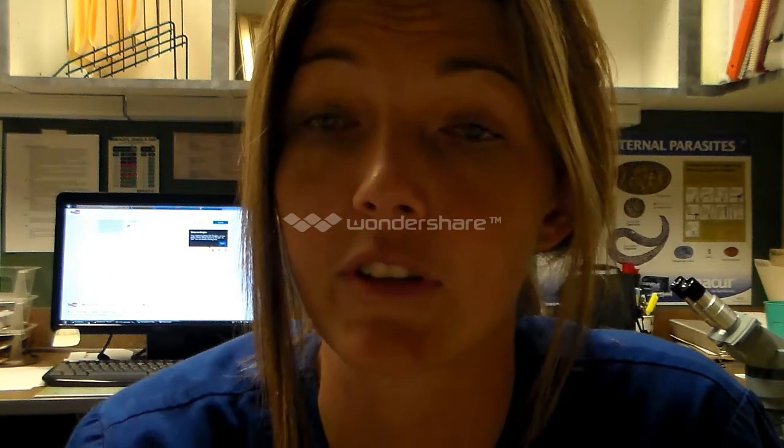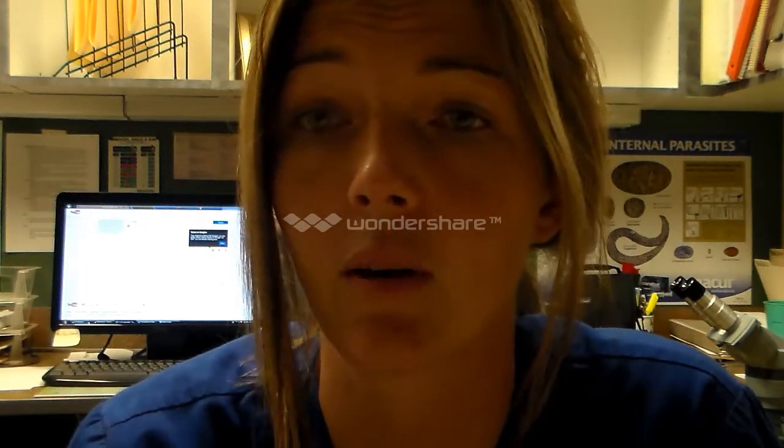So once we've verified those things, physically the first thing that we're going to check is we're just going to look at the incision and make sure that there's no redness. We're going to look for signs of swelling, any kind of discharge. We want to make sure that the skin looks normal and healthy, certainly that the incision is completely closed, that there are no gaping areas, missing sutures, areas of infection, obvious discharge, things like that. Once we've verified that none of those factors are present, then we'll go ahead and remove those sutures.